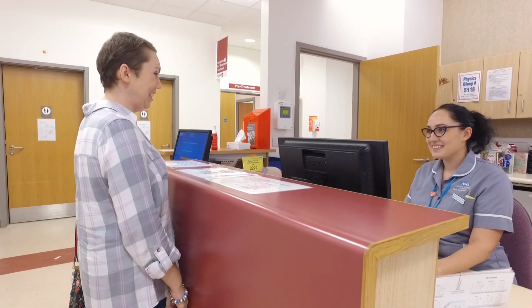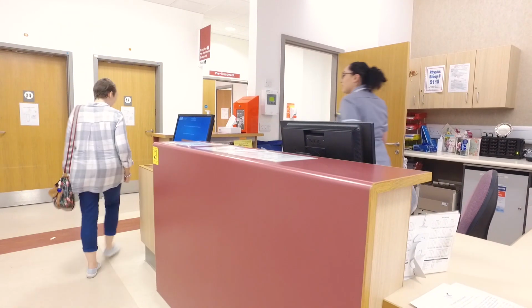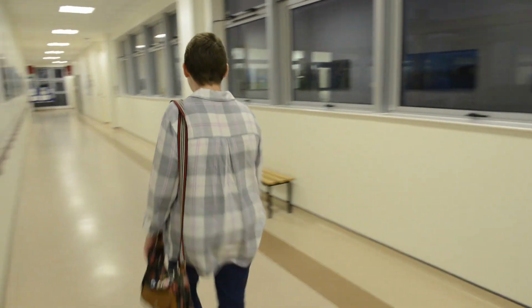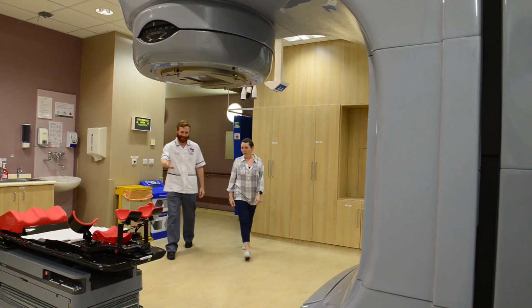When you check in at reception, we will then see that you've arrived, and one of the team will come down and meet you at reception. We'll then bring you up and come into a side room, and again, like at pre-treatment, we'll just run through the treatment process. From the second day, you then check in and you'll walk straight down that corridor, and we'll meet you at the waiting room closer down to the machines. We try to keep you on the same machines for your treatment so that you can get used to the same team. However, due to service capacity and different reasons, sometimes we do have to move you between machines.